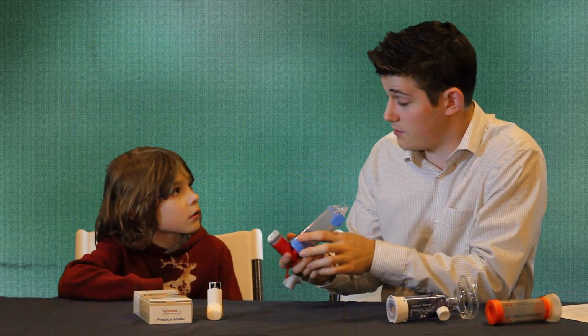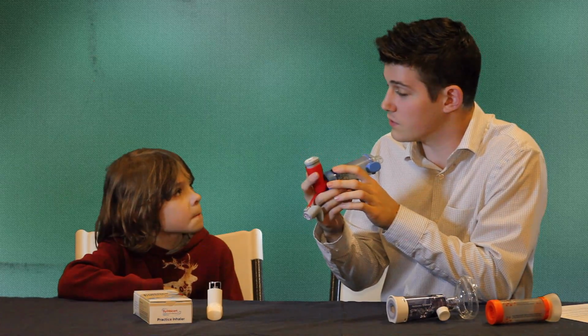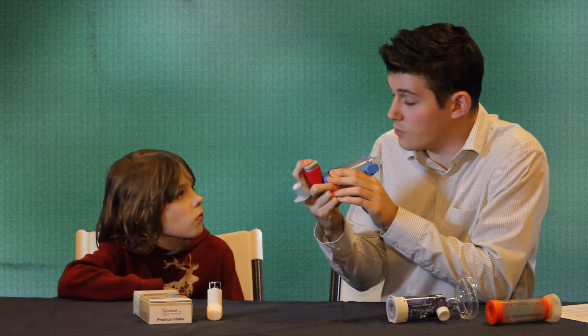Once you breathe all the way out, you put the tip of the spacer between your teeth, close your lips around it, and as you start to breathe in slowly, you press down on the inhaler. This part will be difficult to coordinate for anyone, especially kids, and will take a lot of practice.